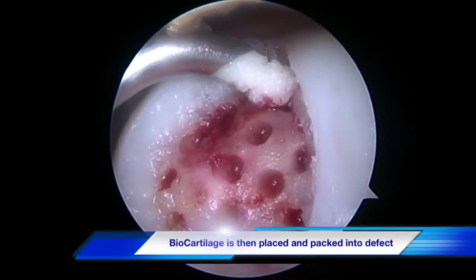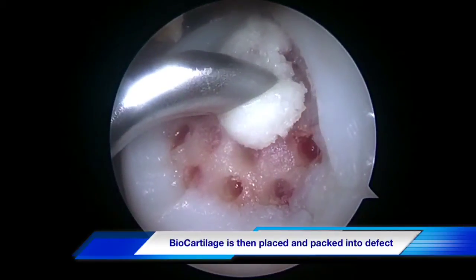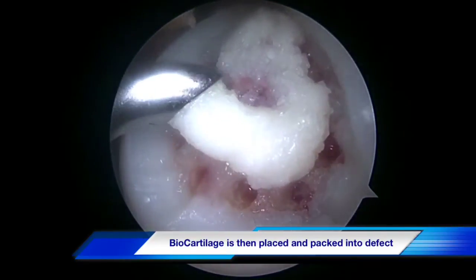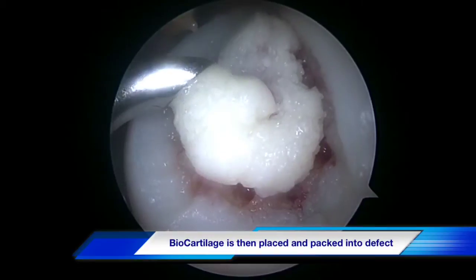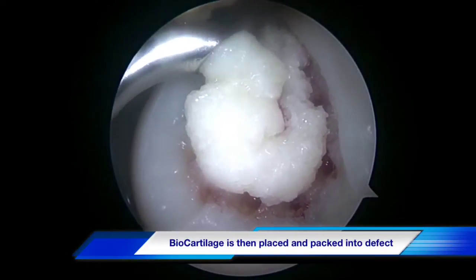The graft itself is commercially available and is mixed with the patient's own platelet-rich plasma, which was obtained at the time of surgery. It is mixed in a syringe and then placed into the knee via a cannula.